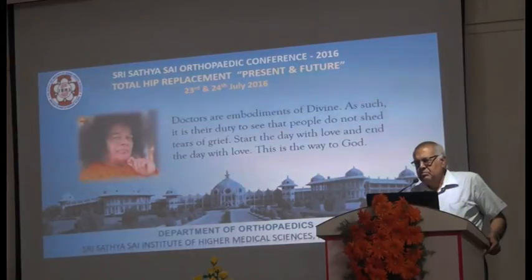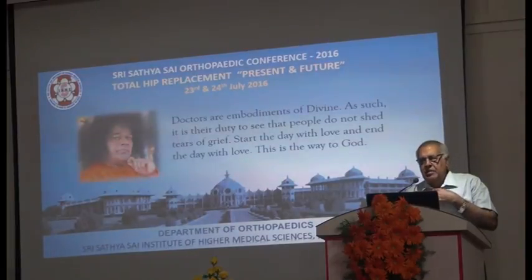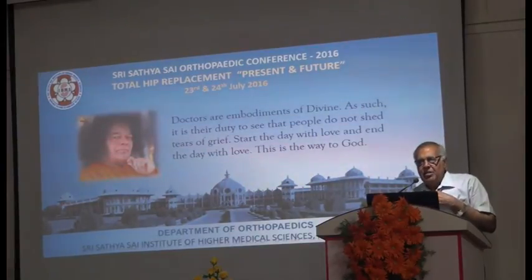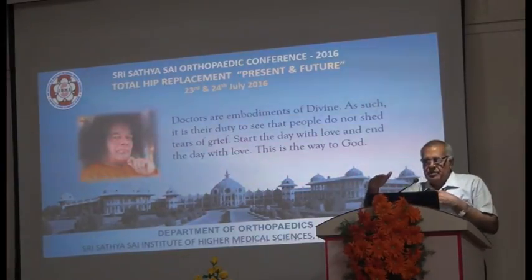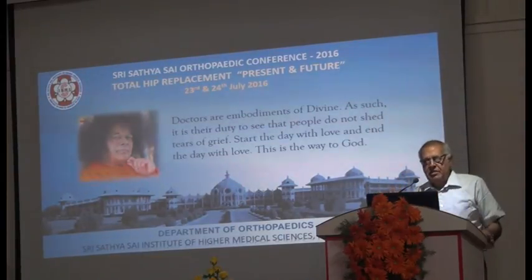Which are not available now. Can we use DHS like things? Yes, you can do it with DHS also, but be careful that there is not too much medialization. With a double angle blade, you can cause lateralization and can give length. But with DHS, which is 135, you will cause more medialization. So you should prevent medialization.